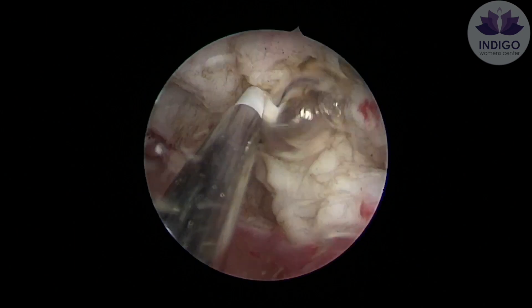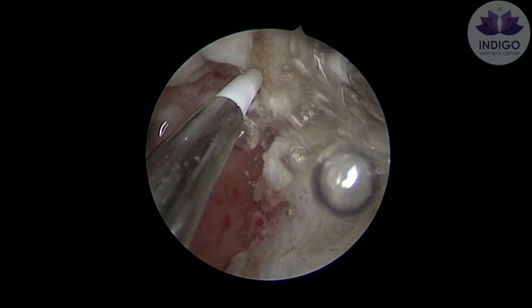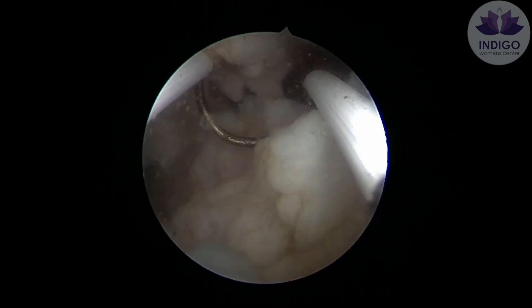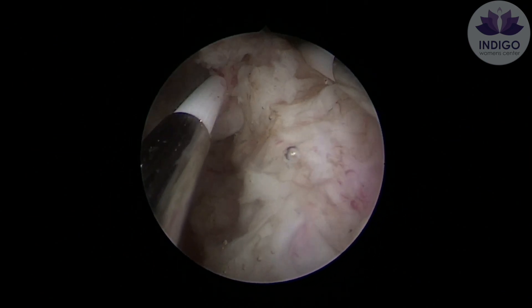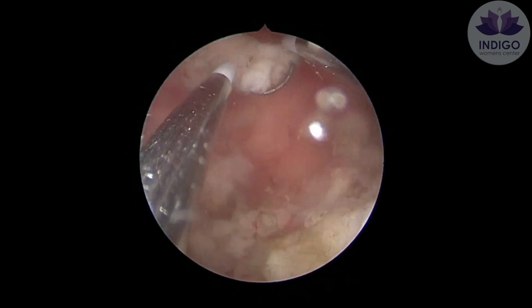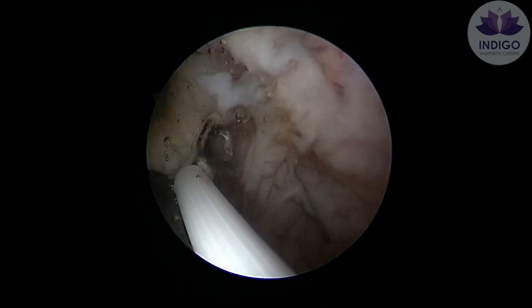Always remember that halfway during the procedure, make sure you remove the resector scope and clear out all the tiny bits, because this helps you in two ways. One, it gives you better vision because the bits and pieces of the fibroid are not moving around. The other reason is that it will help draw the fibroid into the uterine cavity, thus making it easier for you to resect it out.